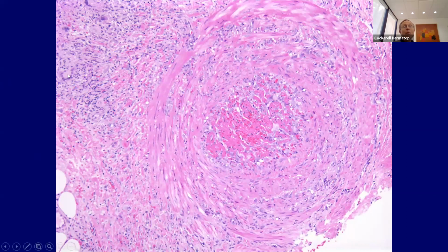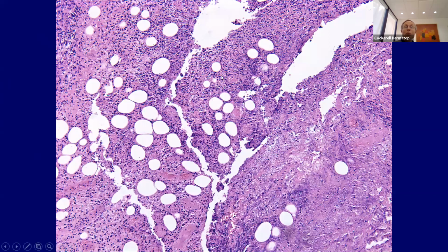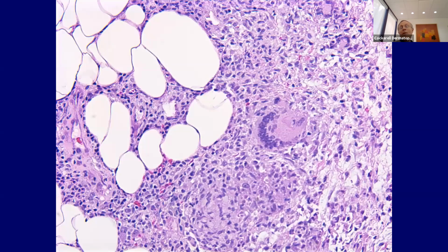The inflammation of the lobule is granulomatous. It looks pretty similar to the inflammation you see with Erythema Nodosum that's involving mostly the septa. So here you get a lot of this lobular inflammation with granulomatous pattern. So it's suppurative granulomatous. And the differential diagnosis is an infectious panniculitis when you see this. So if we saw something like this, unless it had the really classic vasculitis associated with it, we probably would still go ahead and work it up for an infection, but it does give you the suppurative granulomatous inflammation in the lobules with the vasculitis. And if you do stains for microorganisms and cultures, it's going to be negative in the vast majority of these cases.